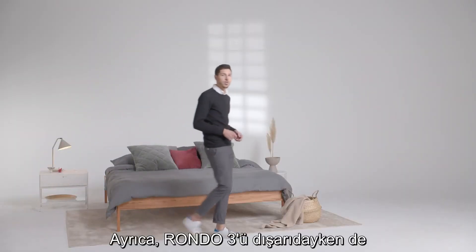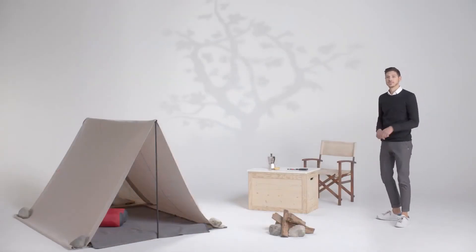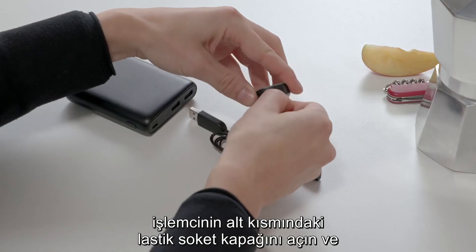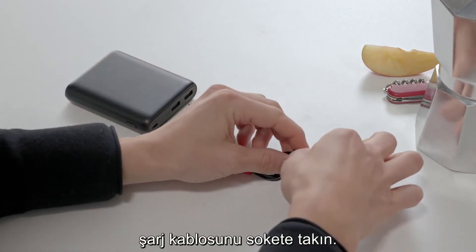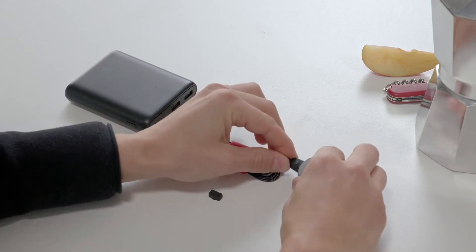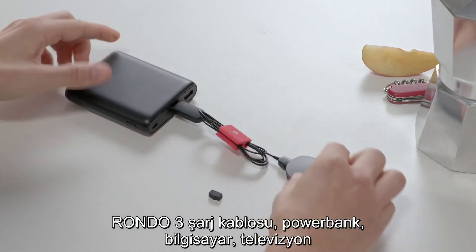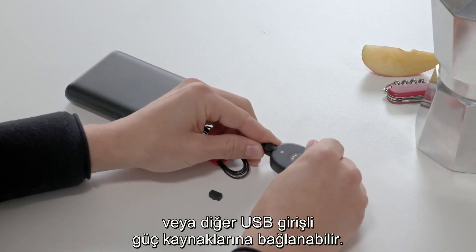You can also charge RONDO3 on the go using the RONDO3 charging cable and the power bank. First open the rubber socket cover at the bottom of your audio processor and plug the charging cable into the socket. Then plug the other end into a power bank. The RONDO3 charging cable can be connected to power banks, computers, TVs, or other USB power sources.